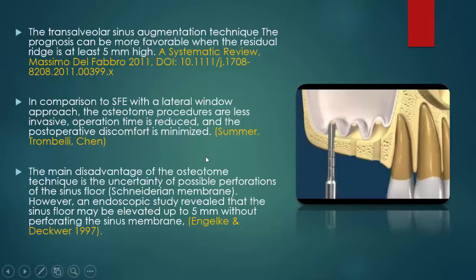طبعا بالمقارنة lateral sinus lift the osteotome procedure are less invasive and the operation time is reduced and the postoperative discomfort is minimized. However, the main disadvantage of the osteotome technique is uncertainty of possible perforation of the sinus floor. لأنه هذا يعتبر blindness technique، ما بنشوف إحنا الساينس ليفت بالكريستال approach، يعني بنعتمد على مبدأ الحس.